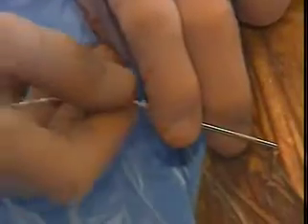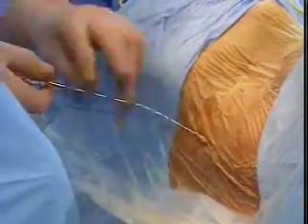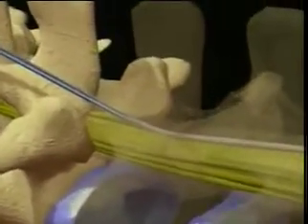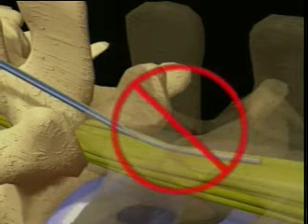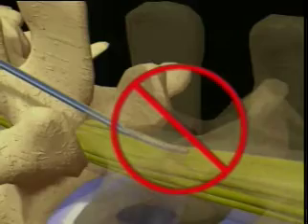Catheter cuts and punctures can be prevented if care is taken in handling the catheter during the implantation procedure. One source of catheter cuts and shearing comes from withdrawing the catheter through the introducer needle during catheter placement. This can partially cut the catheter or completely shear off the catheter end. Do not pull the catheter back to adjust its position while the needle is still inserted in the spinal canal.